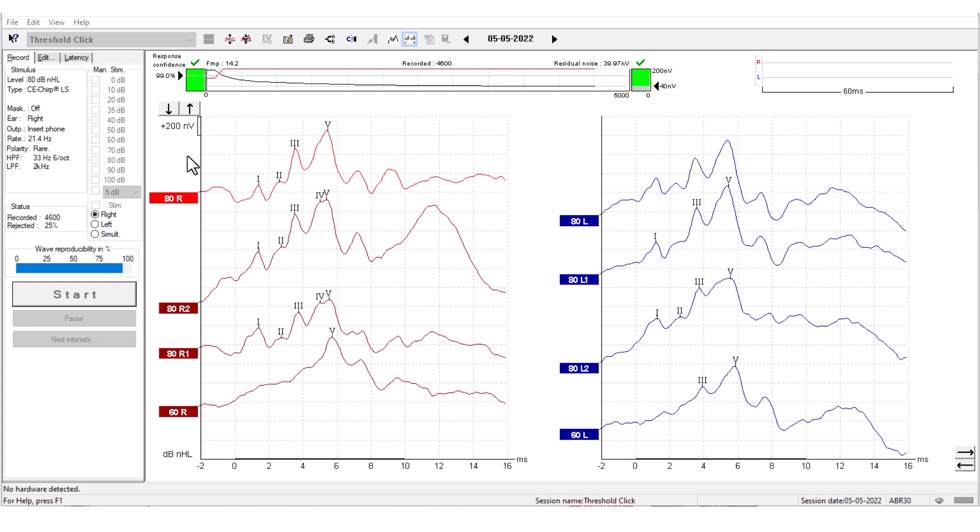As part of the test screen, you have this function called Volt Per Division. You can click these two arrows to increase or decrease the Volt Per Division. This increases or decreases the display of the Volt Per Square, which either makes the waveform bigger or smaller.